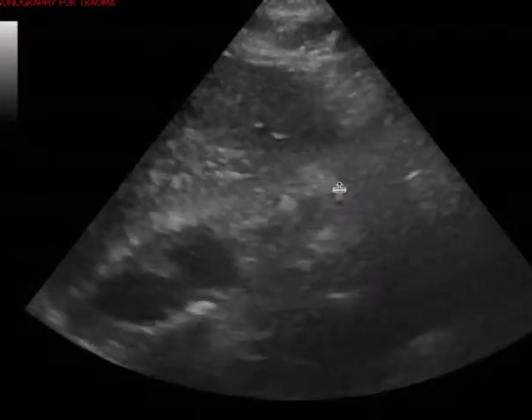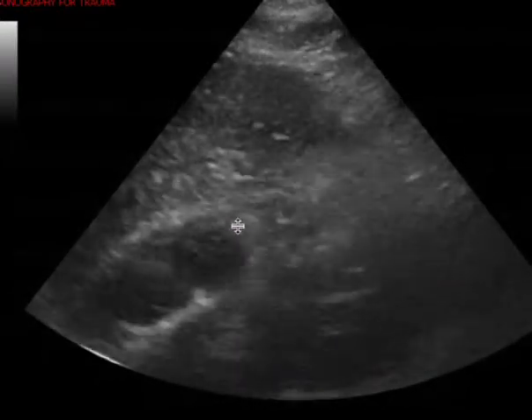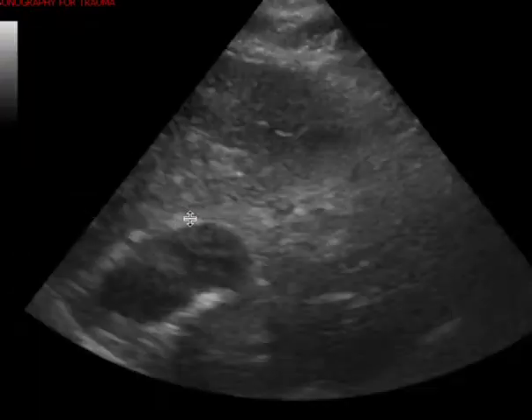This is a cardiac ultrasound. You can see here, this is the subcostal view. This is a pretty sensitive view to look for a pericardial effusion, and I don't see any.